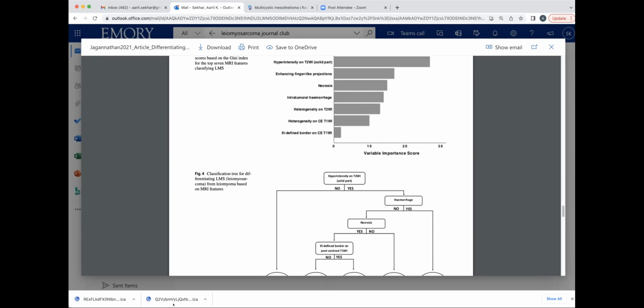And since it is solitary, that might tilt us, because we know the sarcoma is solitary, and myomas can be multiple. So if it is solitary and large like this, then it might tilt us a little bit more towards sarcoma. And the heterogeneous appearance, the T1 hyperintensity, and this nodular contour might also tilt a little bit towards the sarcoma. Restricted diffusion, heterogeneous enhancement, anything.